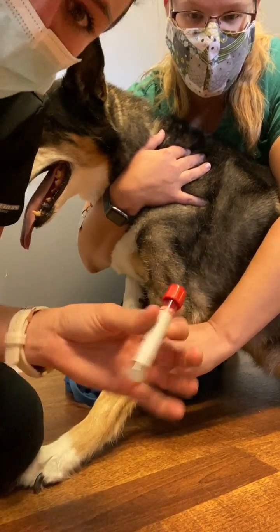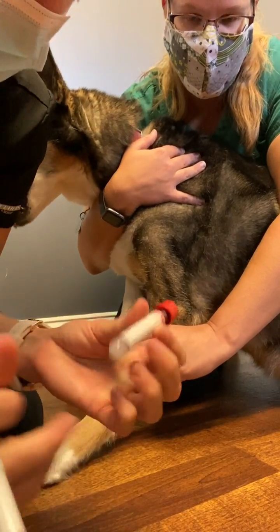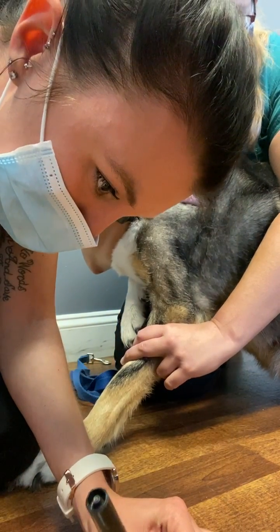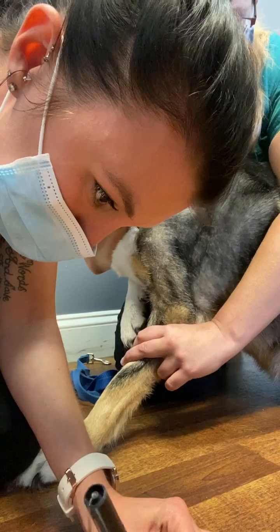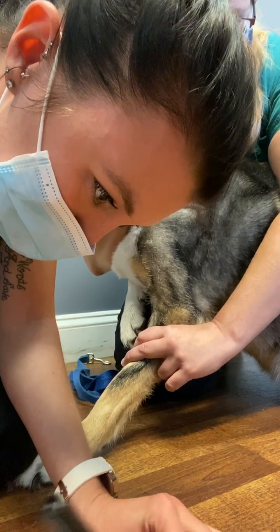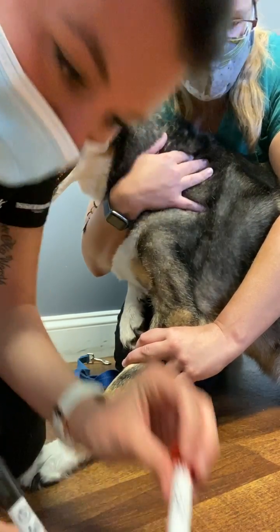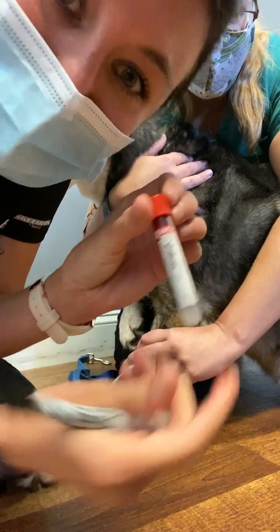Now I'm going to properly label this with the date and the patient's name. We have Tandy Hughes and it is 8/28. And this completes the video.